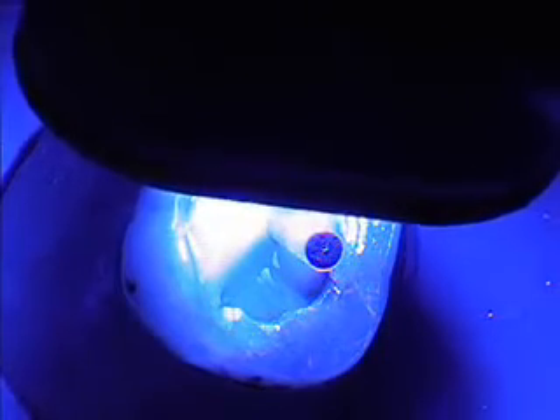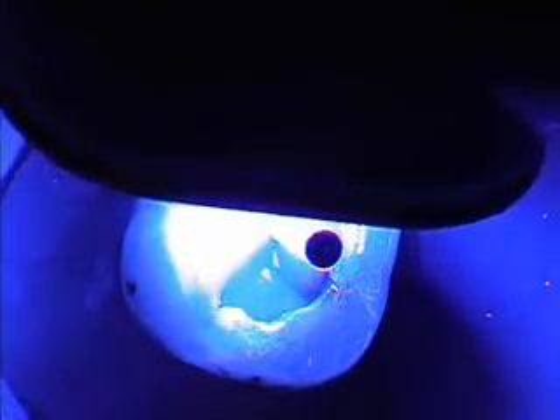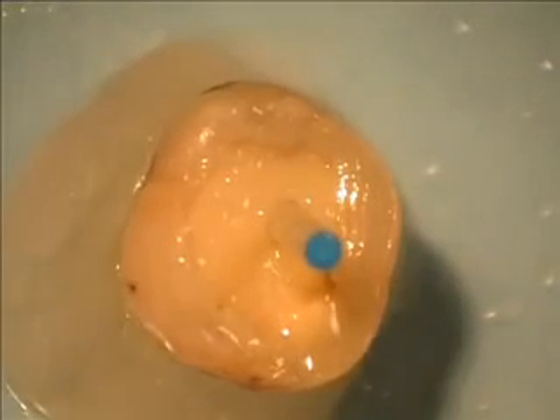The core material is again light activated for ten seconds, and the core is now ready for preparation.